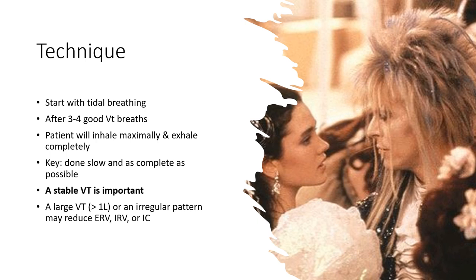All right, so how do I do this in more detail? Well, first things first, I'm going to have them start with slow tidal volume breathing. Slow tidal volume breathing, you'll see it on the spirogram. After about 3 to 4 good tidal volume breaths, the patient will maximally inhale as deep as they can, and then exhale as completely as they can too.